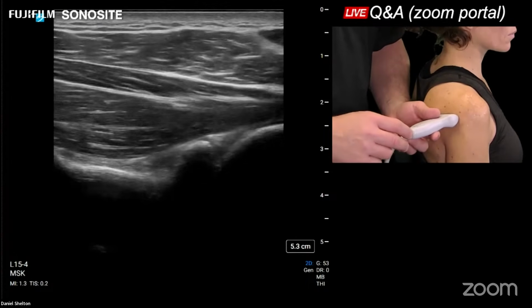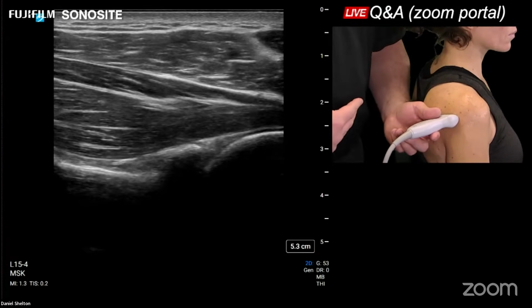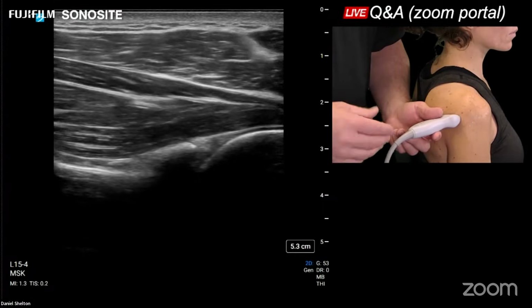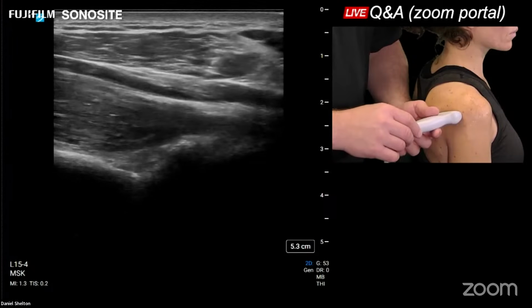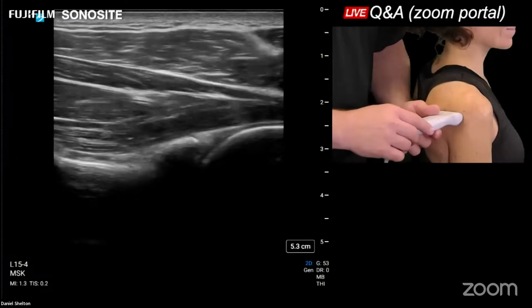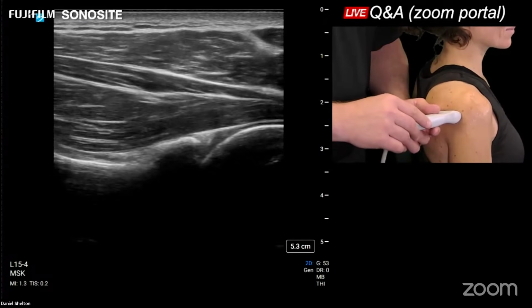I also suggest that you put the patient in a lateral decubitus position and have them face you with the affected arm up, and their front would face your front, and then you get to hold the transducer like a knee injection. It's very efficient, very comfortable for you. And if you have any vasovagal guys, big tough guys that seem to pass out during injections, they're already laying down, very comfortable for everybody.